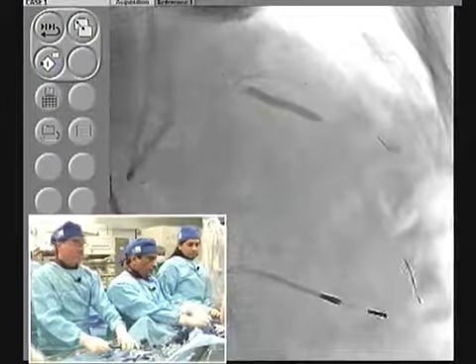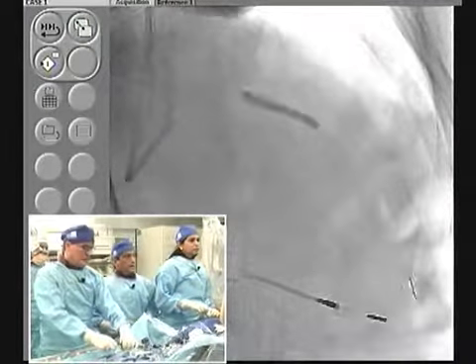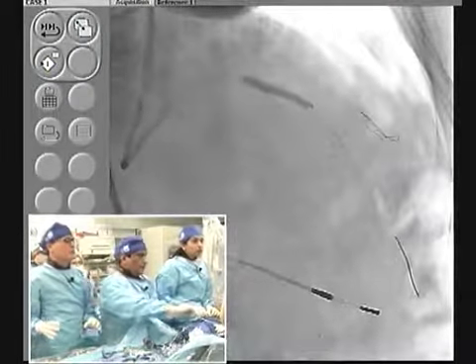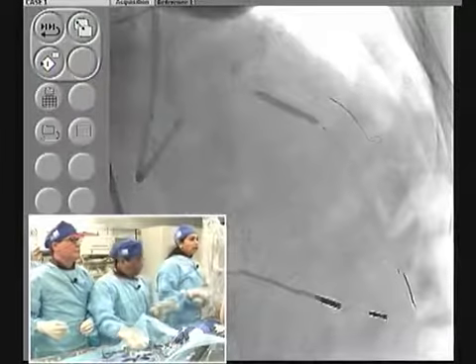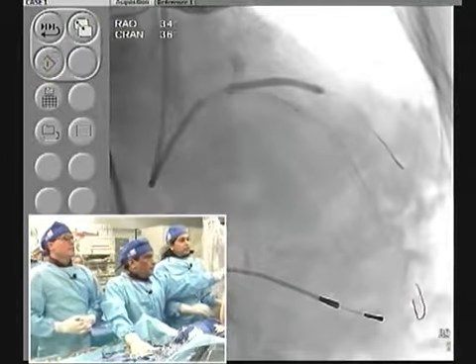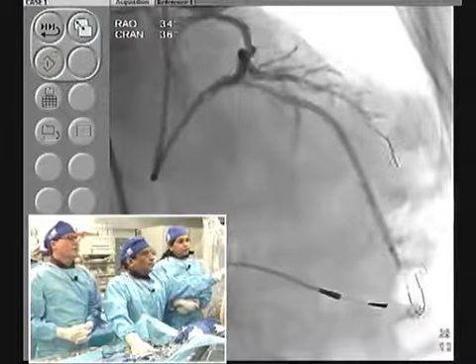In comparison with any other bifurcation stenting, the V doesn't need to recross and kiss balloon. The other ones, all of them should be finished with kissing balloon. Now, important point, look, the guide is out, okay? When we are doing this, once you have deflated, good.